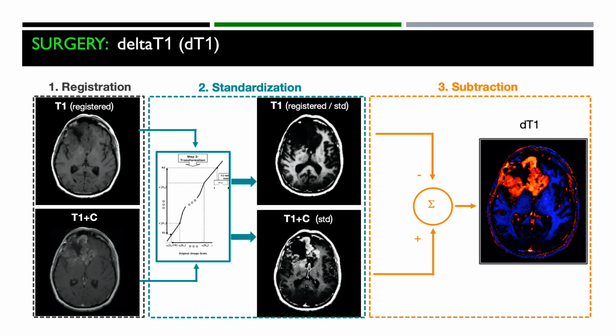And what I mean by much better is it's not confounded by some bright signal that you often see on the image that you acquire before even injecting contrast agent.